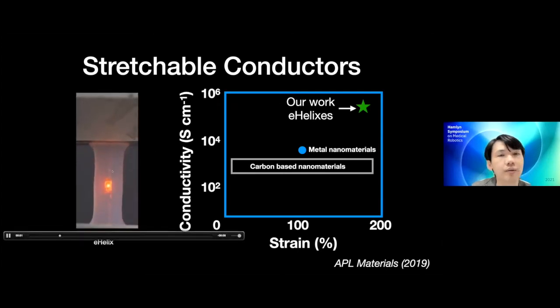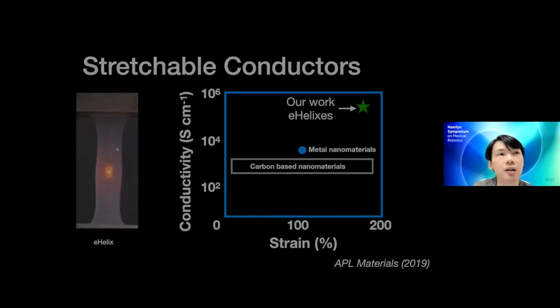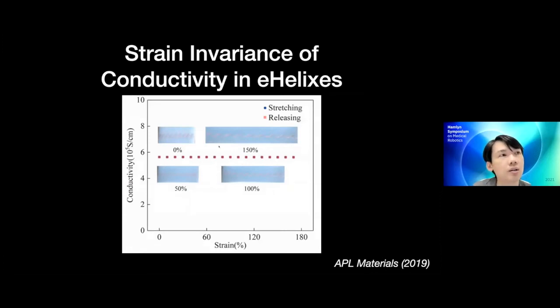So we came out with sort of an e-helix, almost like mimicking the DNA, right? DNA is a helix, and we thought about what if we could make wires in a helical manner and embed them within an elastic substrate. Will we be able to stretch it? It turns out that's kind of obvious, but what's not obvious is the mechanics and interfacial properties of embedding the metal into a soft elastic substrate. So here you can see this video shows an LED connected by the metal helical wires, and the LED brightness is not changing as you strain the conductor. And so this basically means that the conductivity is not changing with mechanical strain, and these are about 100 to 200 micron metal wires. And so you can strain them to 150%, and the conductivity remains very high, right? In fact, it's pretty much invariant.